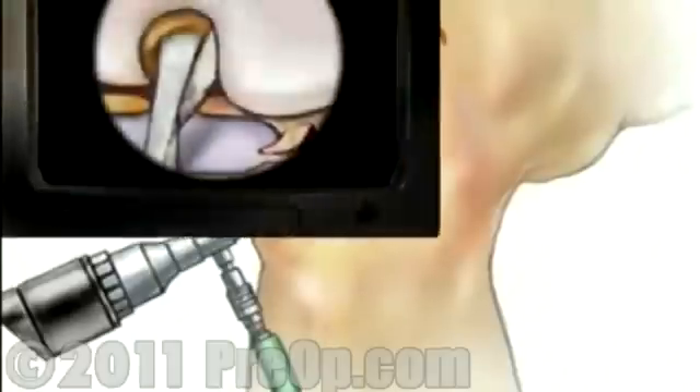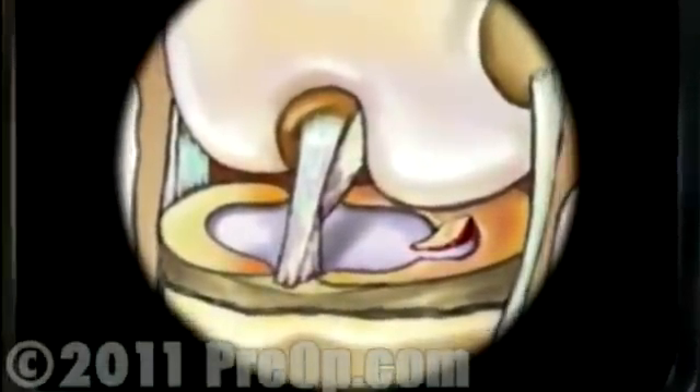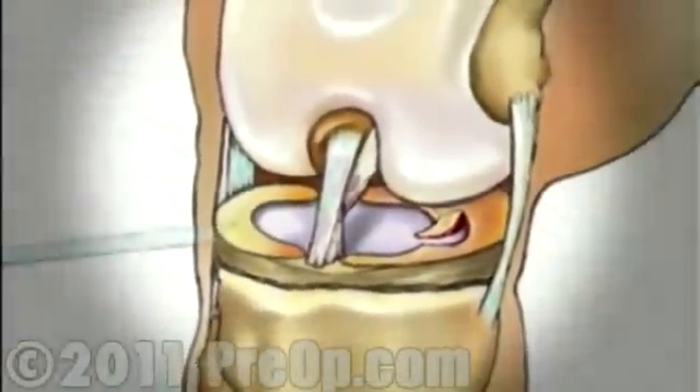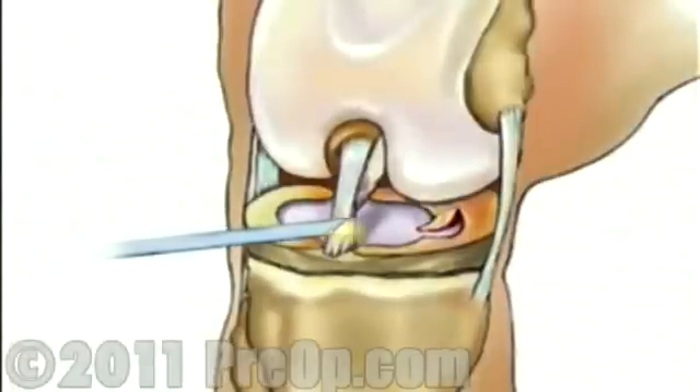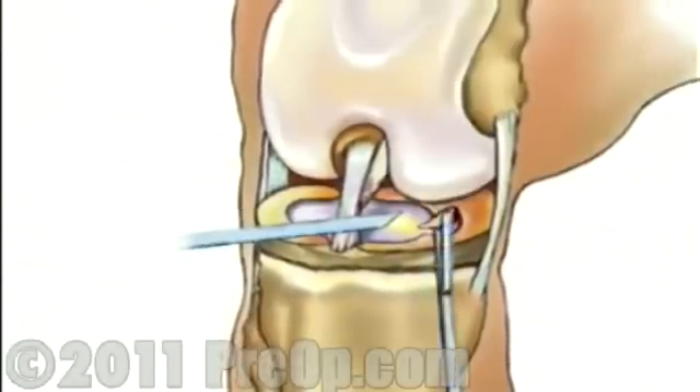Once in place, the arthroscope will provide video images so the surgeon can insert the instruments through one or more small openings. After inspecting the extent of the damage to the meniscus, your doctor will repair the meniscus with tiny staples or remove it altogether.